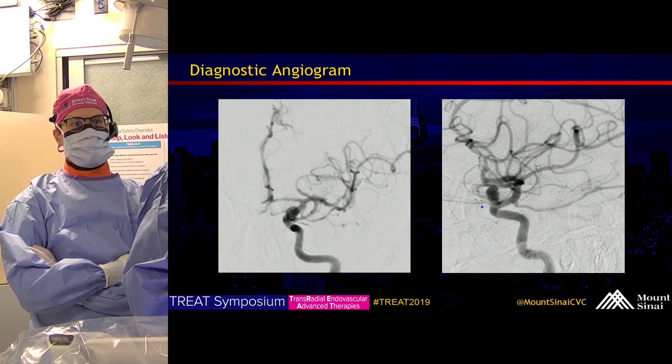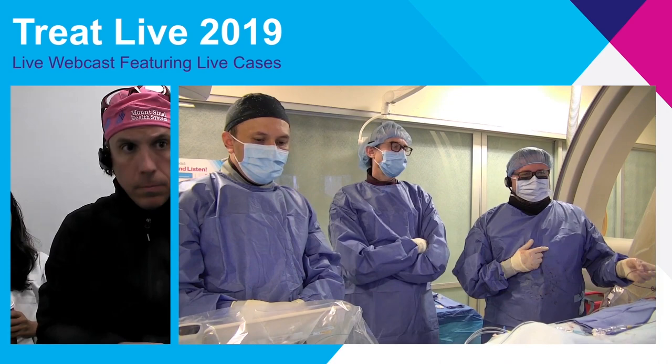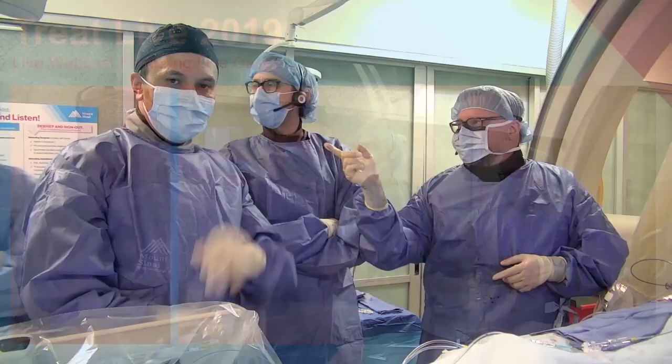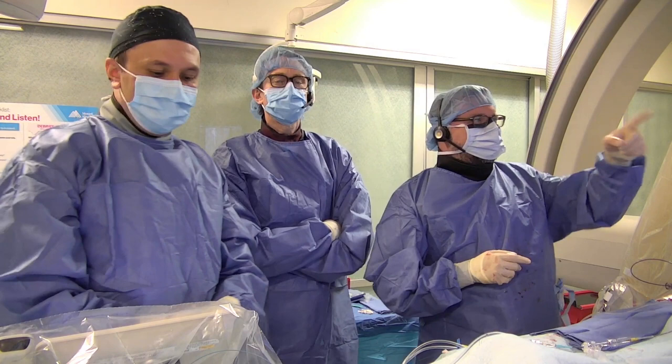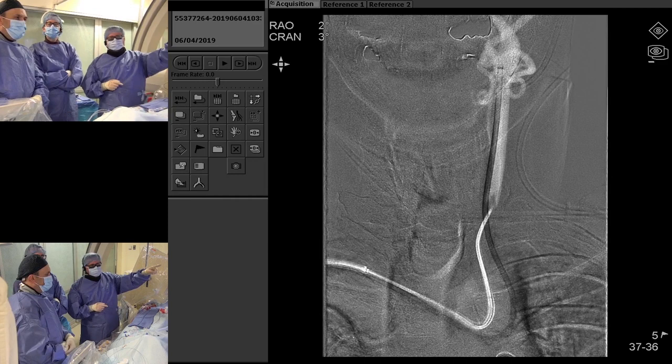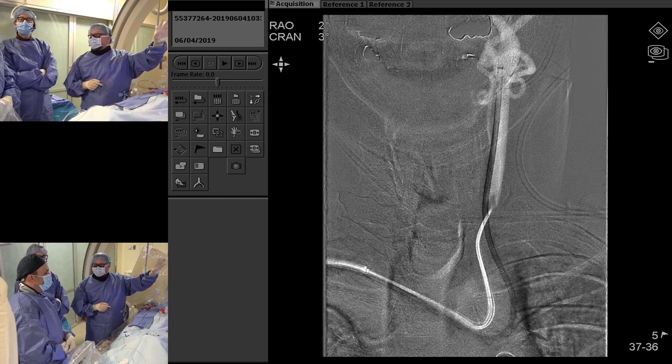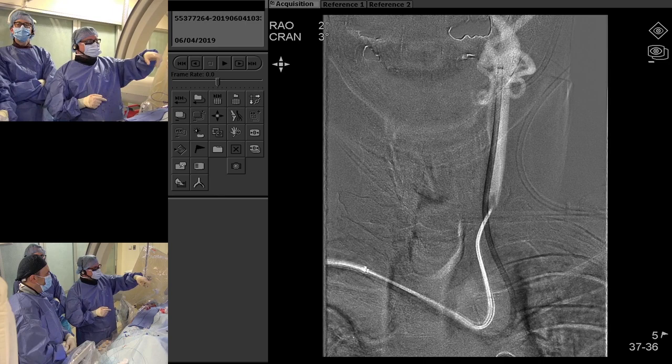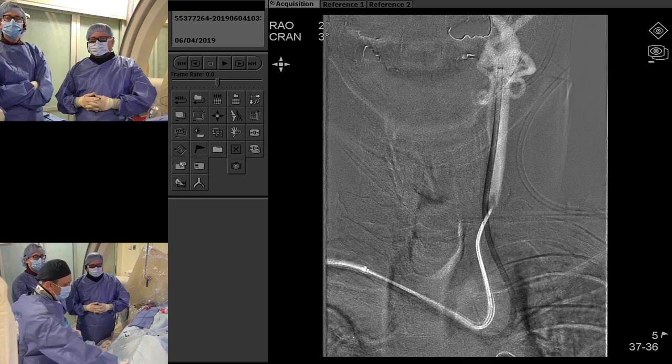My name is Jay Mako, the attending neurosurgeon for the case. My partner and co-attending is Dr. Reid DeLacy, and our fellows are Dr. Sharam and Dr. Kurt. We came transradially, formed a Simmons 2 in the right common, did a run of the head to make sure no clots went up, and then used it to select the left carotid. We put a 038 glide wire up into the internal and brought the Neuron Max, which is an 088 guide, into the proximal left internal carotid artery.